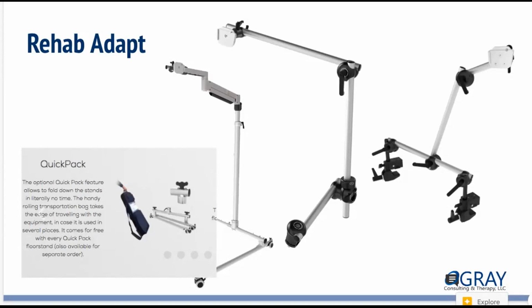The other really nice thing for funding purposes, so both Rehab Adapt, and then I'm going to show you next Ideas for Independent Living, will, if you're going from something like this to something like this double, you can use the same top half and then just need this one additional piece.